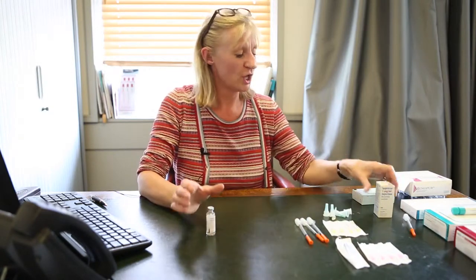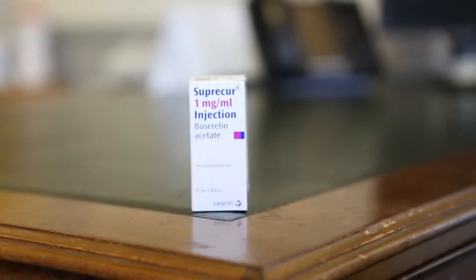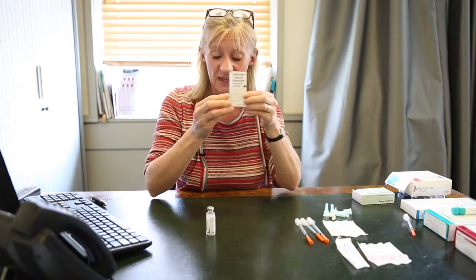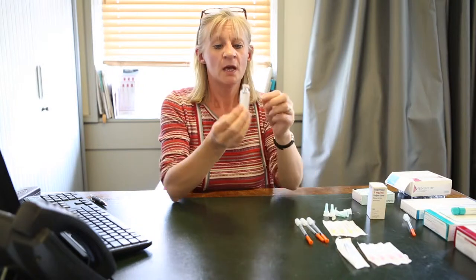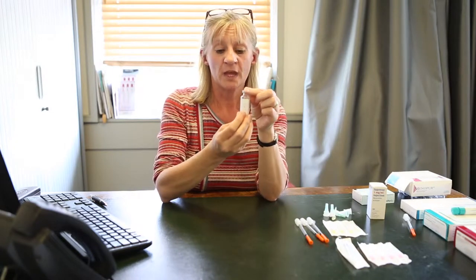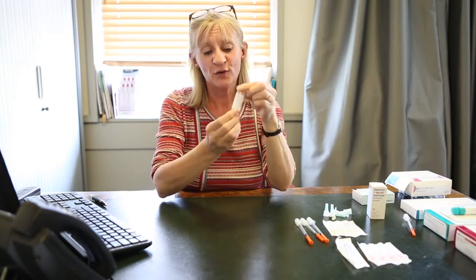The first drug I'm going to show you how to inject is something called buserelin — it's actually called Suprecur, but we always refer to it as buserelin. Your buserelin will come in a box like this; you take it out of the box and it looks like this. It is a fluid. There are 5.5 mls in this bottle and mine, as you can see, is being used.